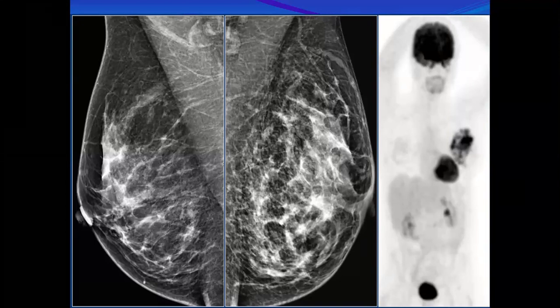Let me ask you one question. If you have an enlarged breast with global asymmetry, and another patient with a small breast, where the breast associated with global asymmetry is smaller compared to the contralateral breast, which one can you make suspicious? You can report it as suspicious, or you will raise the suspicion. The enlarged breast or the smaller breast? This one doesn't show significant enlargement, more or less the same size, but shows these edematous changes.